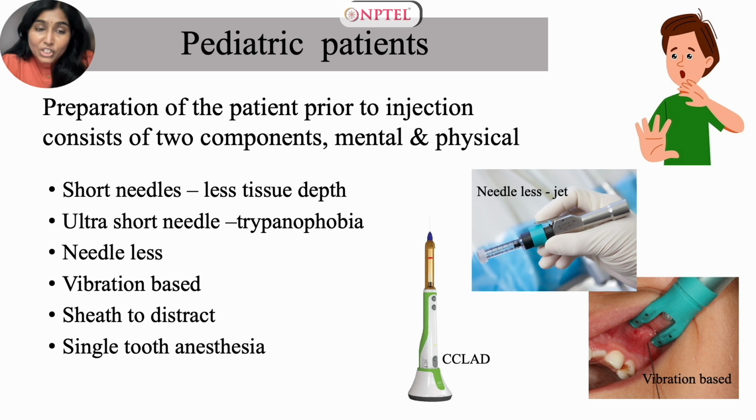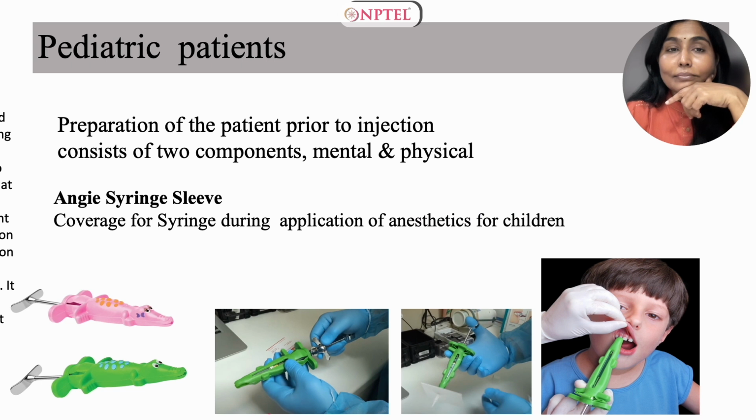Funny shaped sheets can also be used to cover the syringes. I would be showing these in the subsequent slides. These sheets can also be used to cover the syringes to distract a pediatric patient. Also, consider a single tooth anesthesia because in these patients you wouldn't want exaggerated periods of soft tissue anesthesia, especially involving the lip or the tongue.